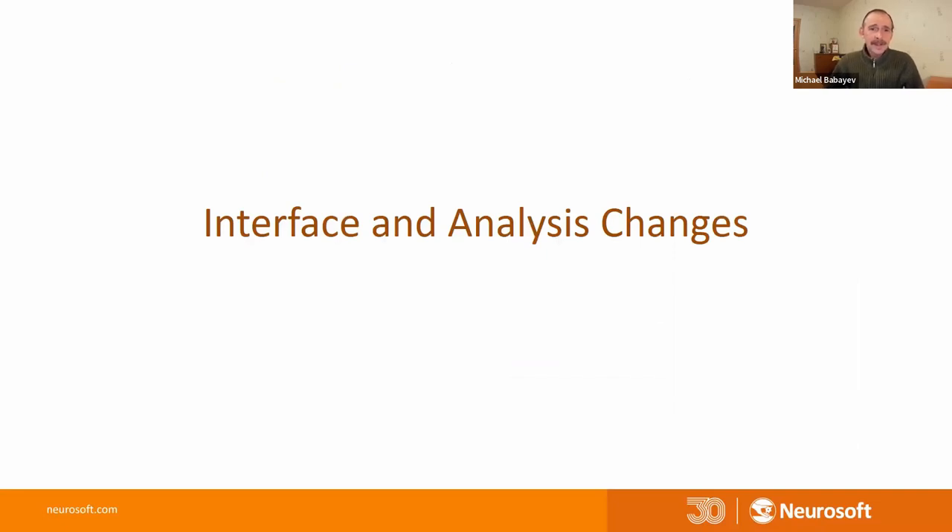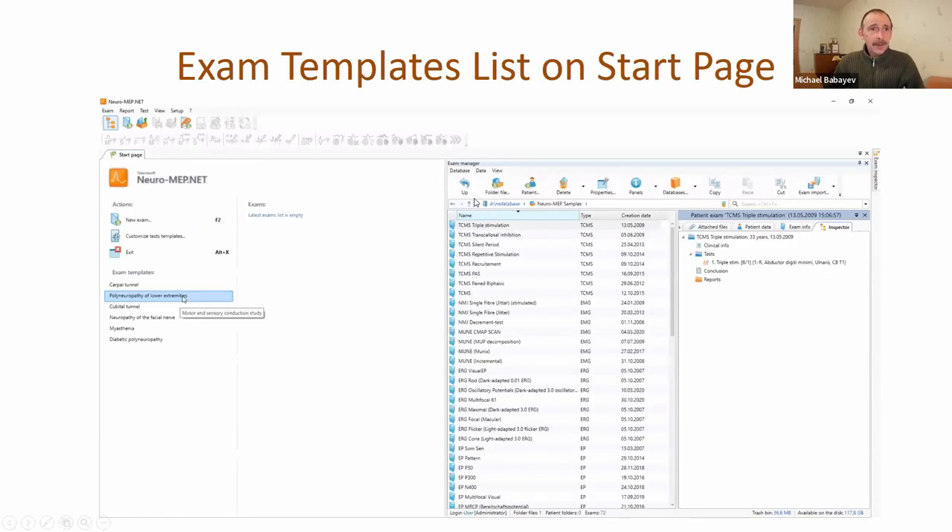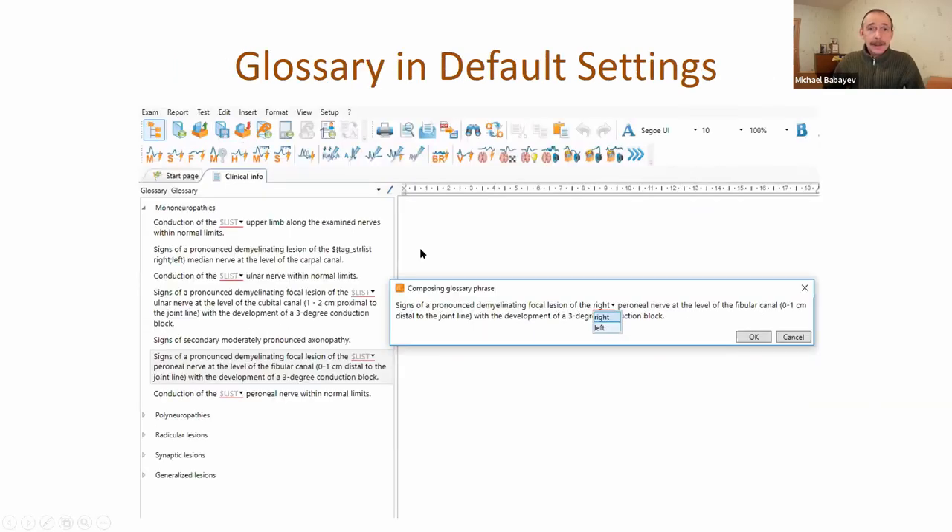Now let's go to interface and analysis changes in the program. First, we added an exam templates list on the start page. Previously, it was necessary to go to the New Exam window and select from a drop-down list, but now you can create an examination with only one mouse click and the program will guide you through all necessary tests. The glossary with default sentences I already showed you - in this glossary you can change phrases, add new phrases, create groups, and so on. It's very easy to create a conclusion.